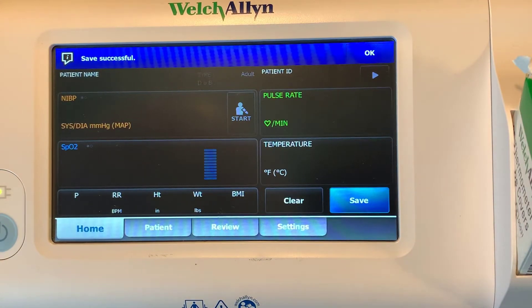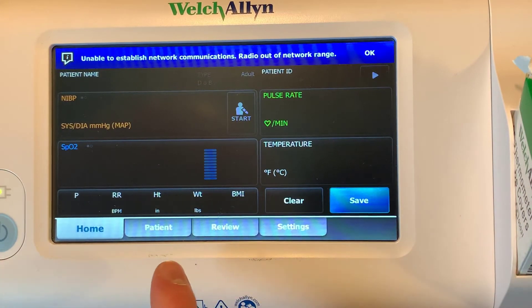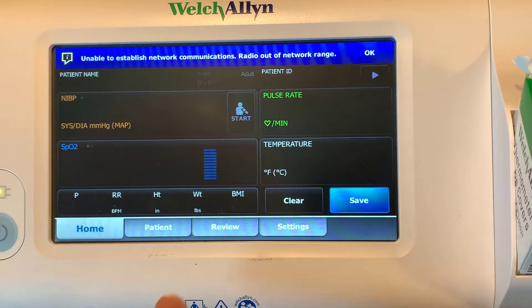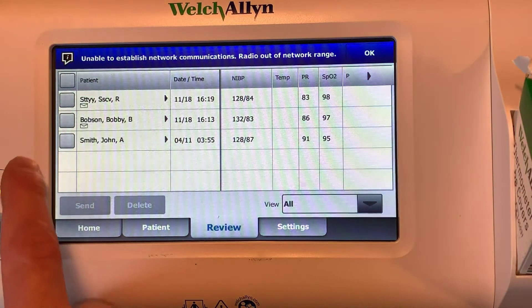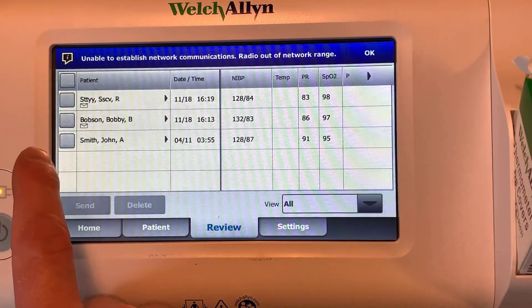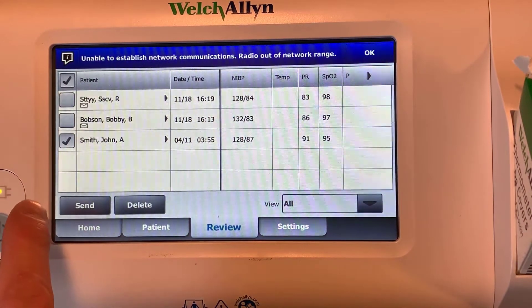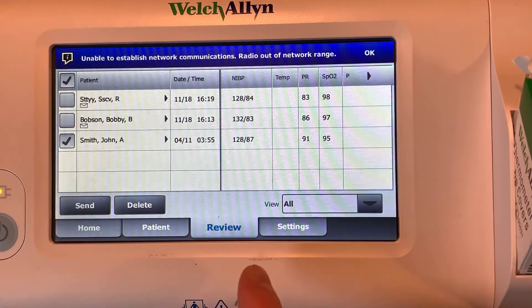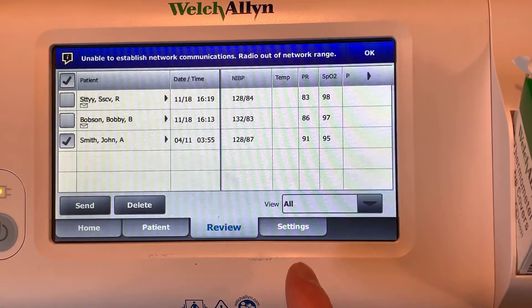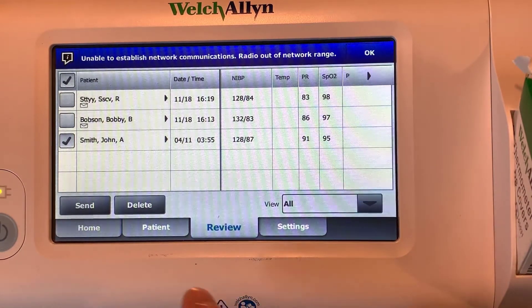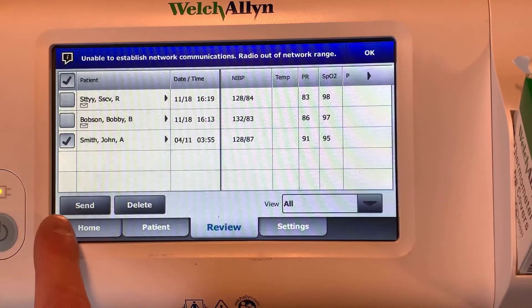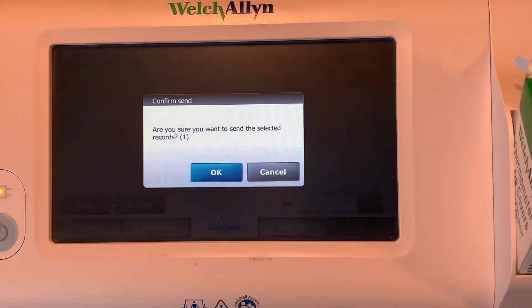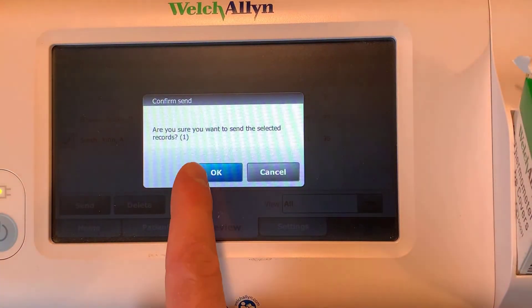I'm going to click OK and now I can hit save. That will save the data into the Welch Allyn. And now if I go to review, I have a couple different records already here, but I can click on the one I just made and then send that over to our server. Just click the check mark there and hit send, then click OK.